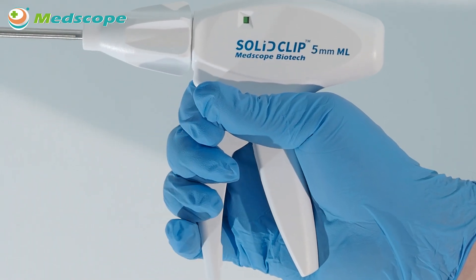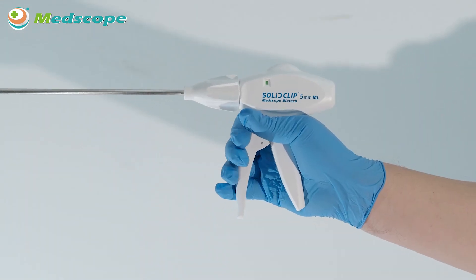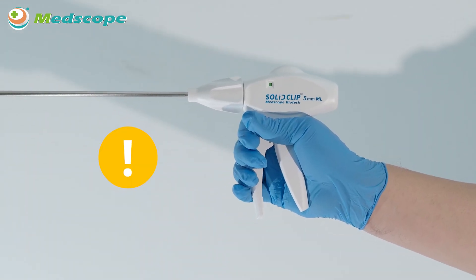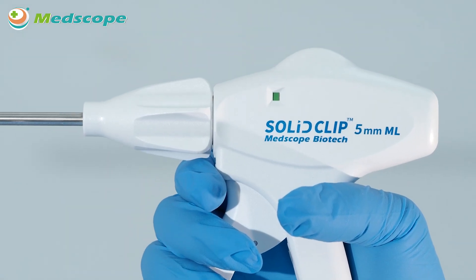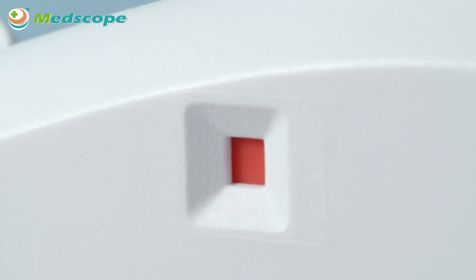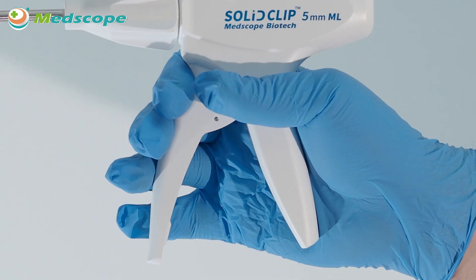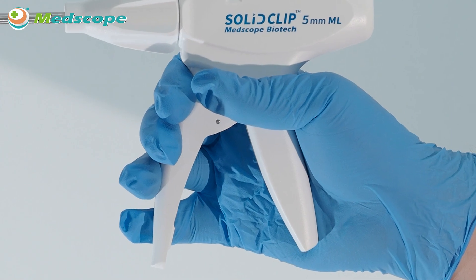When the clip is placed in the right position, an audible click will be felt and heard. Failure to squeeze the trigger fully can cause a malformed clip, which may result in bleeding or damage of the tissue. The counter window will show green and red to warn the user that there are only 3 clips left in the clip applier. When there are no clips left, the counter window will show red, indicating the clip quantity is 0.